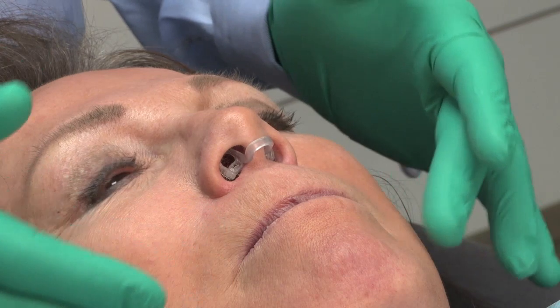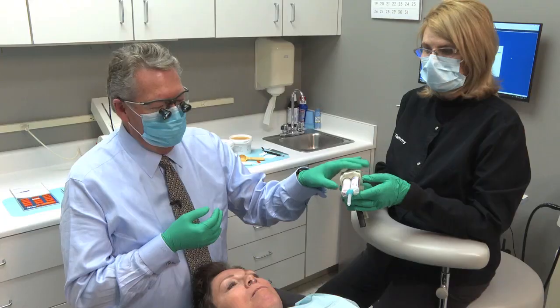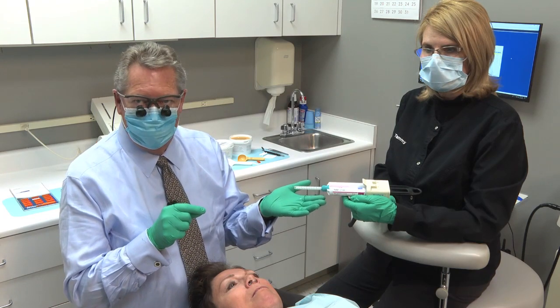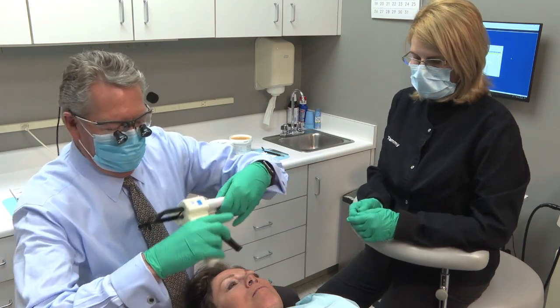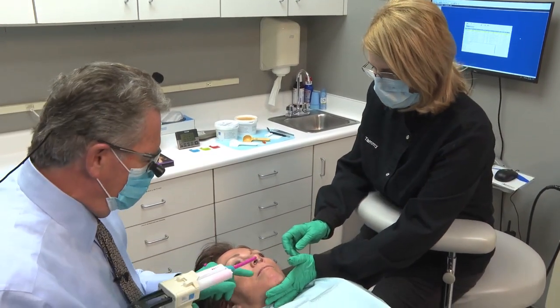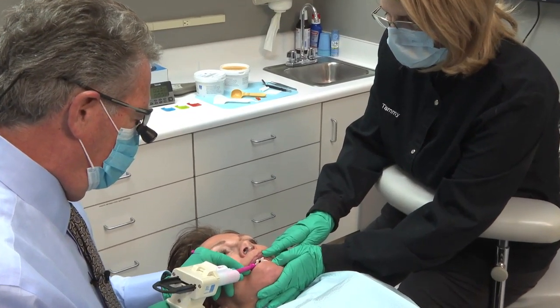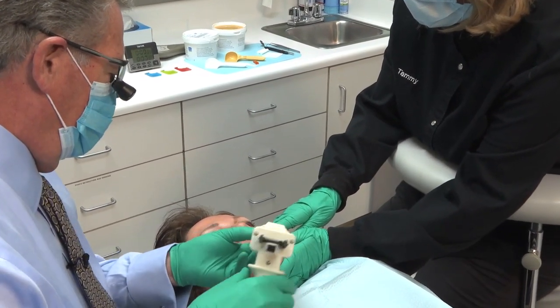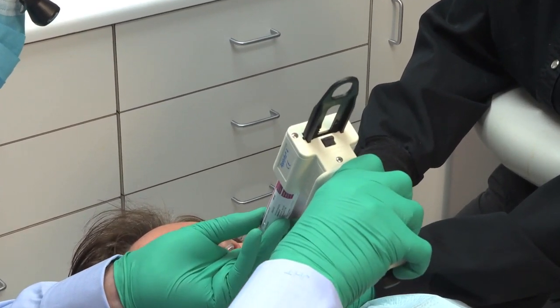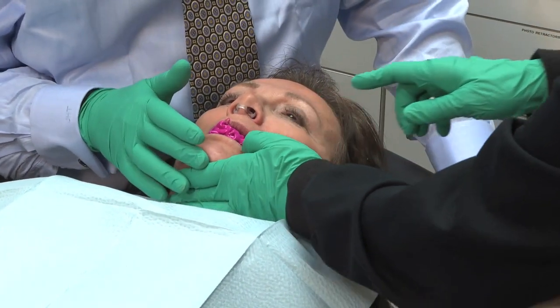So we have taken a posterior bite on the right and left side. I'd now like to get an anterior stop. What we're going to do now is take our Futar D and register the bite in the anterior segment. And you want to express a little bit of the material out. Just stay together, Kim, and relax your lips. And we're going to simply place our Futar D in the anterior areas. And this will provide a nice anterior stop so that the lab gets a better mount for their models.